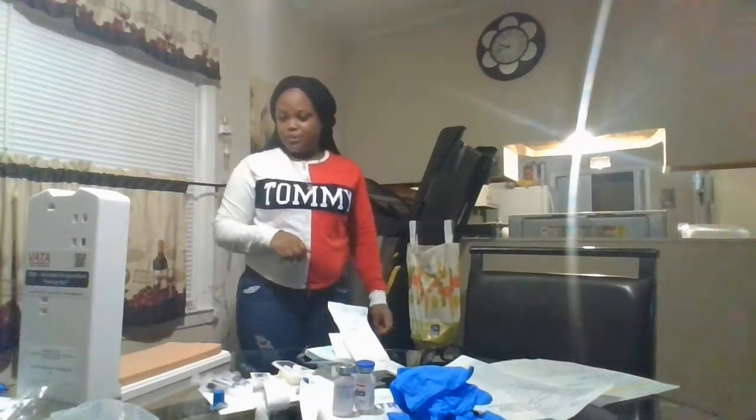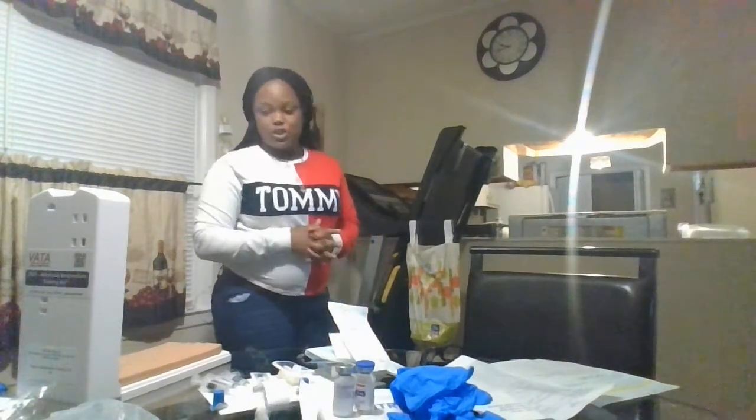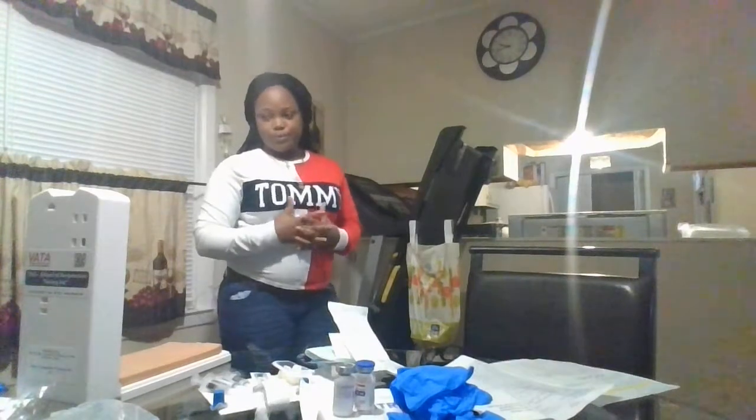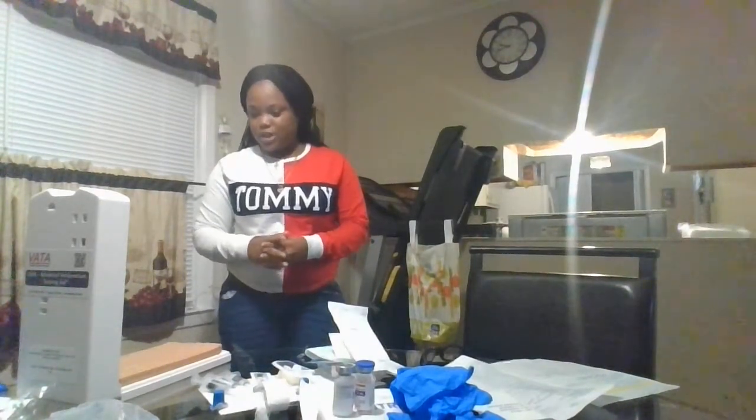My name is Khdivstart, and I'm going to be your nurse for today. Today I'm going to be starting an IV because I got reports that you were having a lot of crackles and problems with output, so for dehydration.